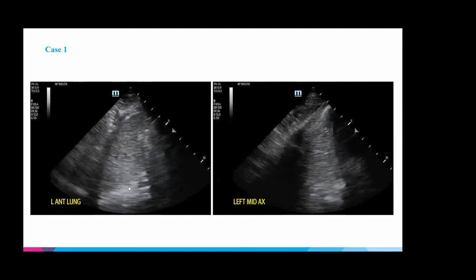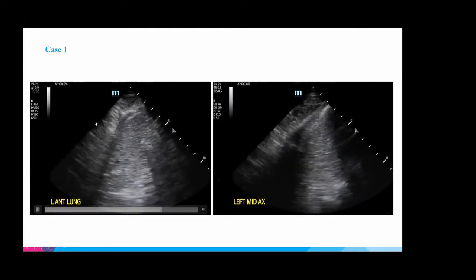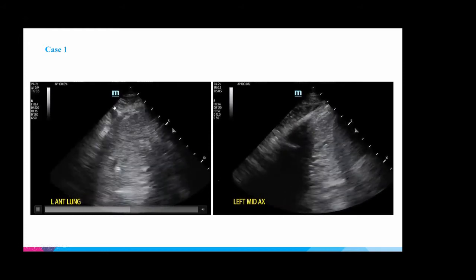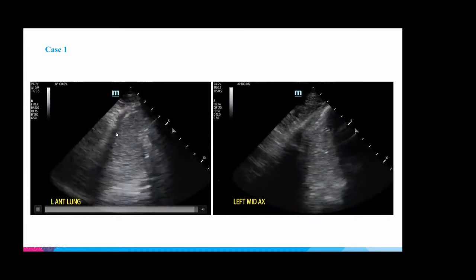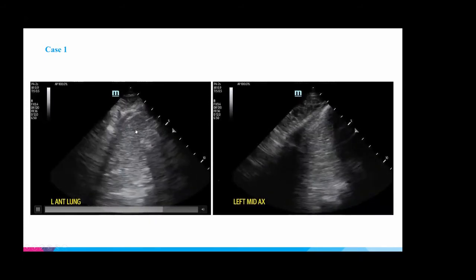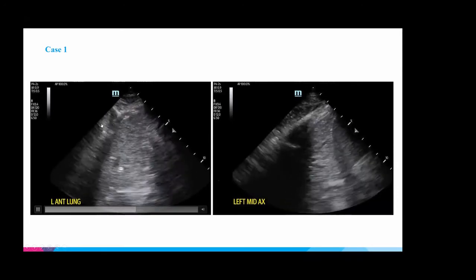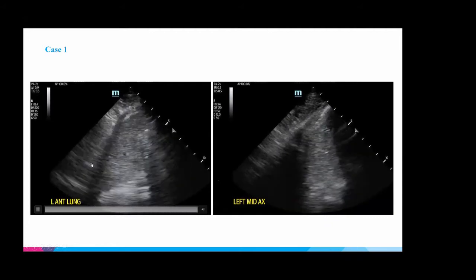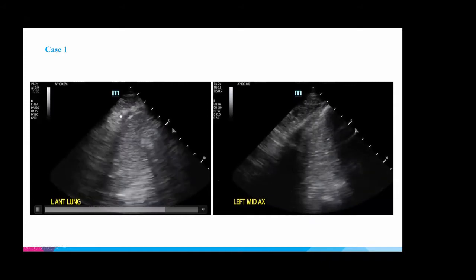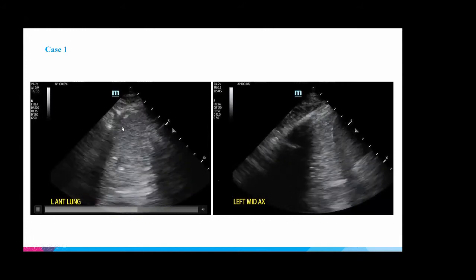Hepatization of the lung. Yeah, definitely. This is kind of confusing over here, right? If you're in the second, third intercostal space, why are we seeing potentially diaphragm already, or below the diaphragm, like a spleen or other abdominal structures? But you can guess we're in the thorax because you can see something beating pretty quickly right here. So this is the heart structure. And if this is directly next to the heart and we're not near the diaphragm, this is potentially a large lung hepatization.